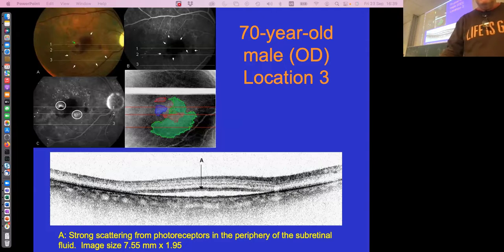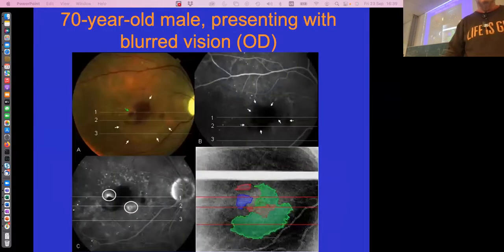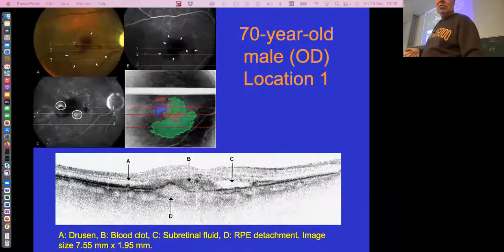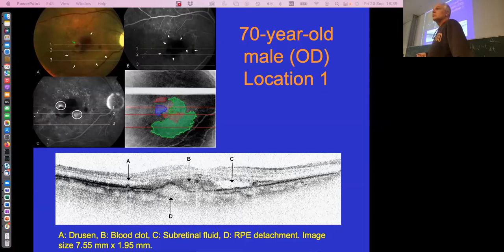I think that you can appreciate what OCT has done in ophthalmology. I mean, previously you had to diagnose a patient in this image or on these two images, and with OCT you basically could show really the disruptions in the layers and what was going on with this patient. If you go to an ophthalmologist, it's nearly standard. If you go to your optician, for glasses, some of you might already have gotten an OCT for God knows what reason, but I do it.